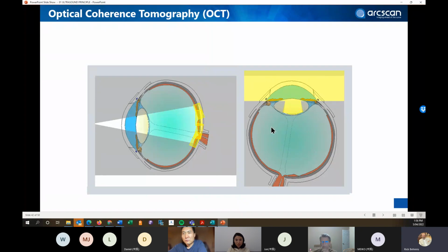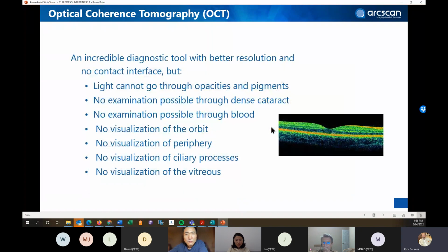So it is a much better one. And I'm a big fan of OCTs. I sold OCT for many years. I think it's a breakthrough what they do, and it's fantastic to evaluate the retina like that. But when you want to evaluate a structure that is behind the sclera, the OCT doesn't work at all.